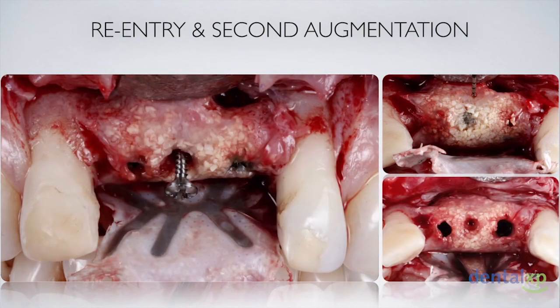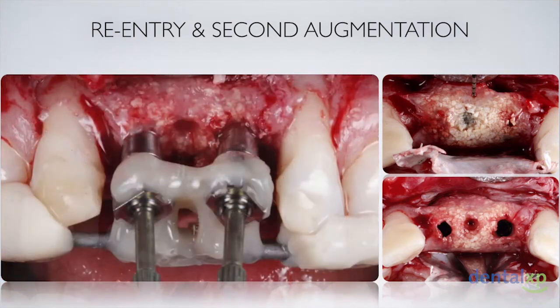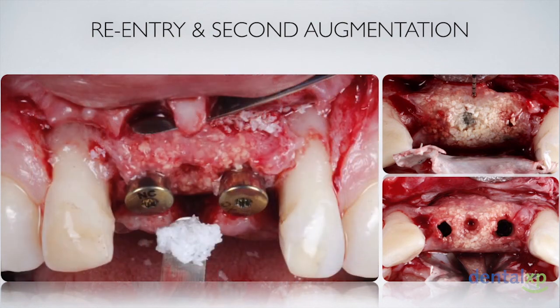We removed the tenting screw and the implants were indexed to allow us to have a provisional ready for the time of second stage uncovering, and delivering 2 longer healing abutments in the site was then performed, in addition to some xenograft bone material that was placed in the sites of the voids to fill the area of the tenting screw and any irregularities we may have had.